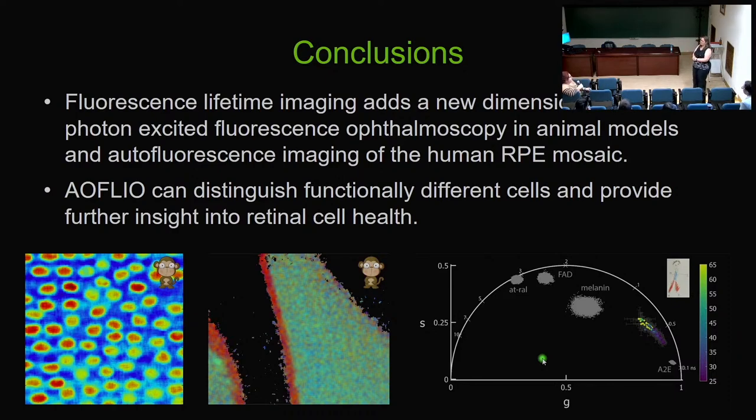Because the clinical one, I don't know, they don't differentiate between layers, right? The clinical one is going to have the entire retina, plus they have an artifact from lens fluorescence. Ah, yeah. And so there's minimal confocality there, and so they have the entire thing. One of the things that makes it really interesting, and that we haven't done yet, is that they're getting fluorescence from the entire thing. We don't match perfectly, so there's fluorescence coming from somewhere else.